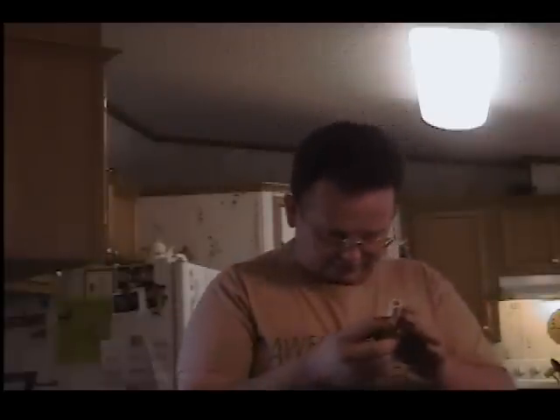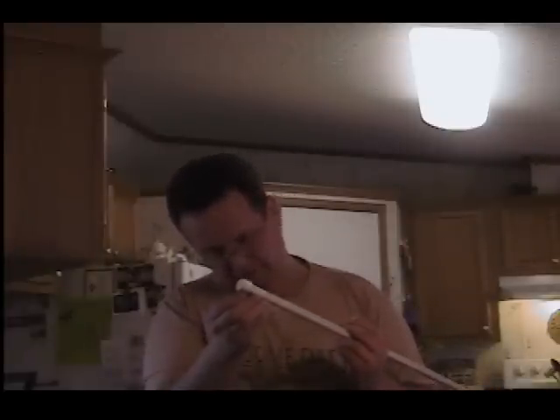To get my measurements, I took advantage of this. I used super glue to put this all together, Loctite super glue, the Ultra Control. Put the cap on, and then took a quick measurement. I wanted to make sure that the complete barrel of the needle, the metallic part that's exposed, has got to be all the way in. So when you cut your end off, that would be exposed out the end of your pipe cap, which I just laid up here, did it the easy way, got it matched up, marked my tube, and cut it off with this.